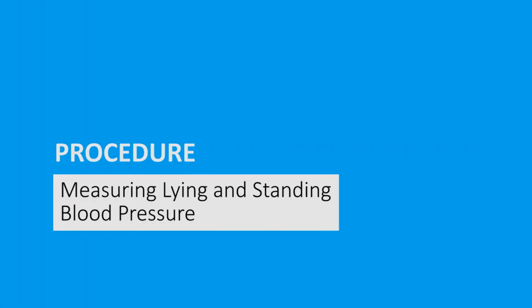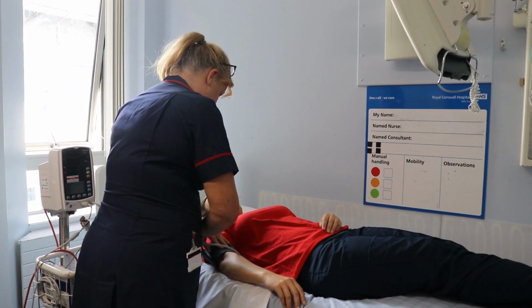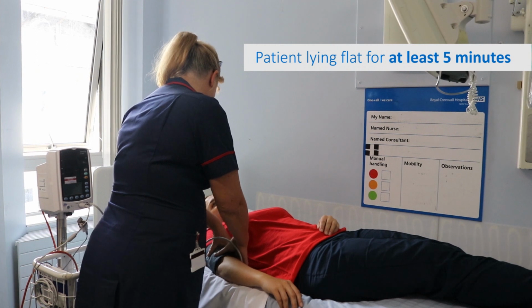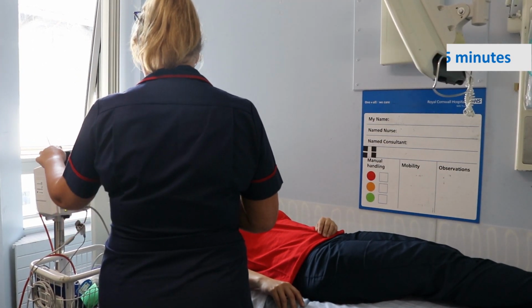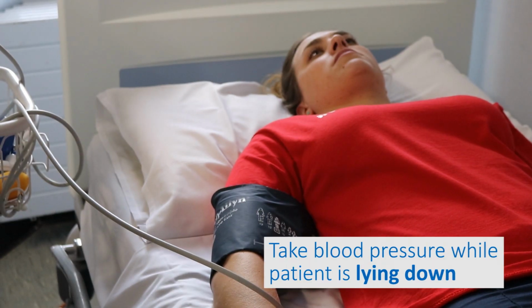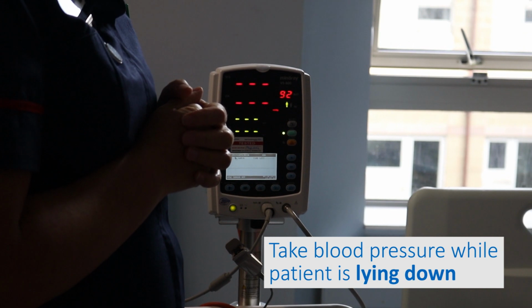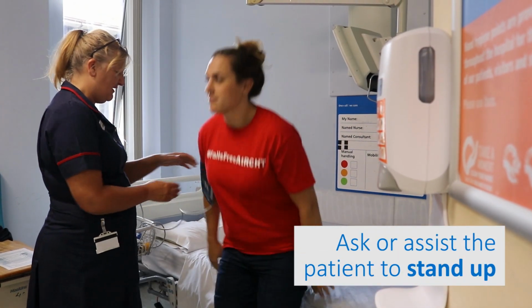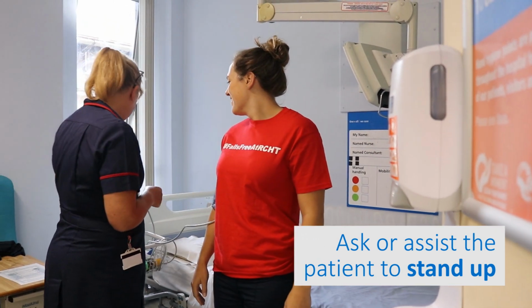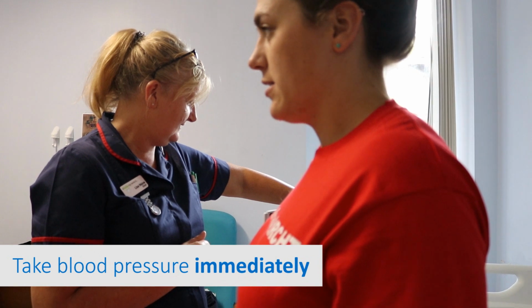Procedure: measuring lying and standing blood pressure. Ensure the patient has been lying down for 5 minutes. Take the blood pressure whilst the patient is lying down. Ask or assist the patient to stand up. Take the blood pressure immediately.